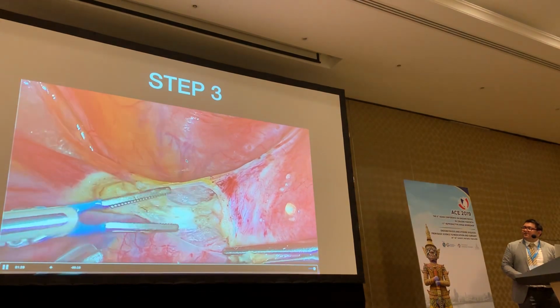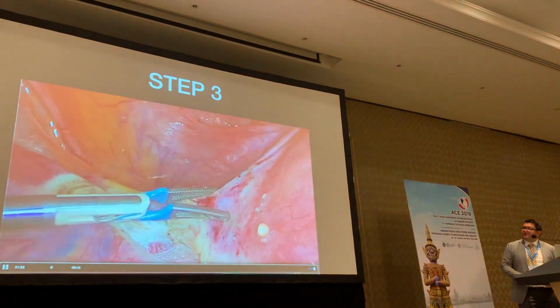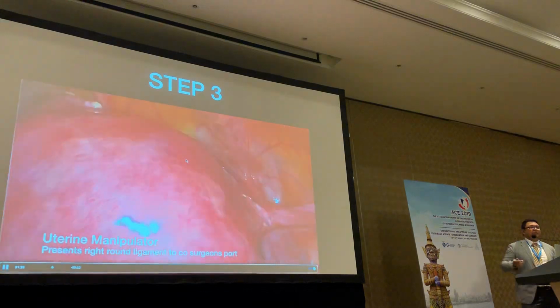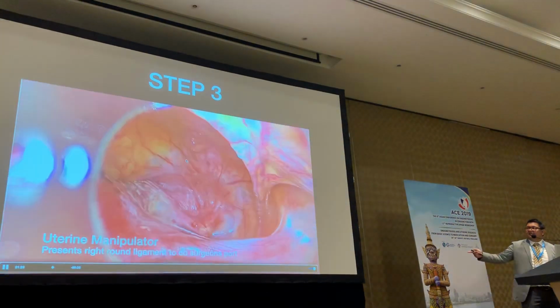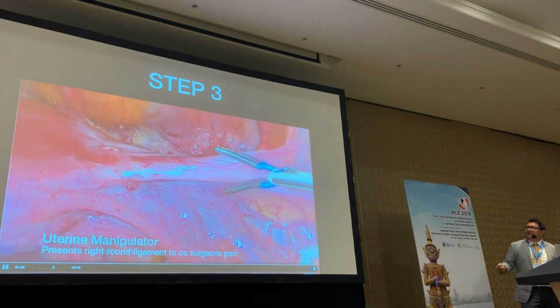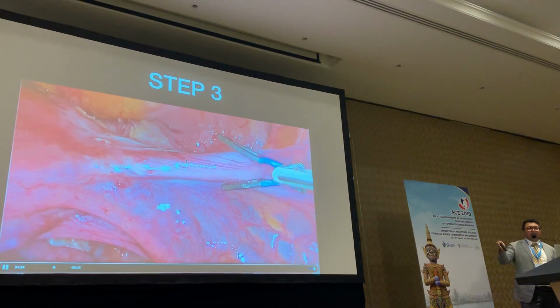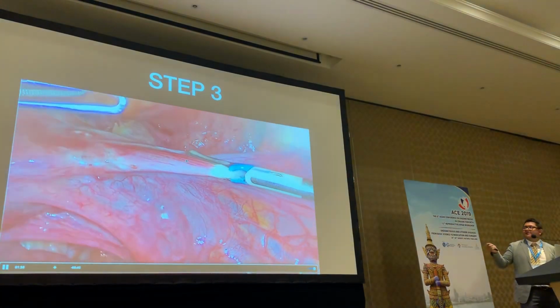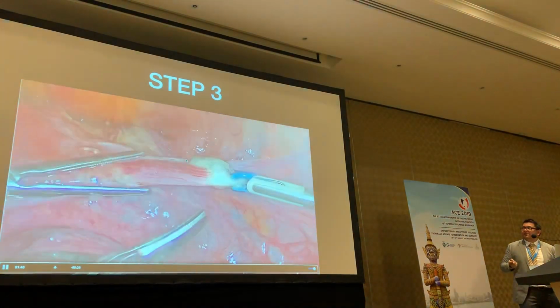And just use the bipolar as a good dissector. Now, on the other side, a lot of people will reach across with their right hand, but I like to give it to my co-surgeon so that the approach is exactly perpendicular to the pedicle you're taking. This applies for the round ligaments and the uterines, as you see later on.